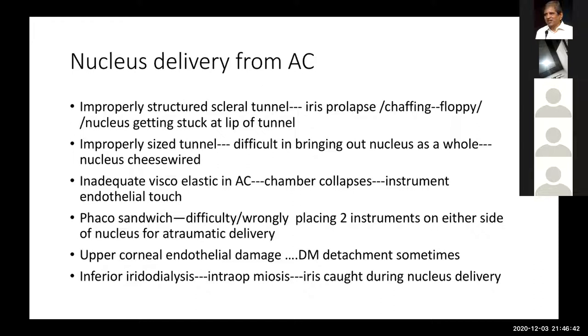And while delivering the nucleus outside from the anterior chamber, the nucleus can get stuck at the lip of the tunnel also. These are all the problems we usually face if the tunnel is not done properly and the nucleus delivery is attempted in such a situation. Next is the size of the tunnel.